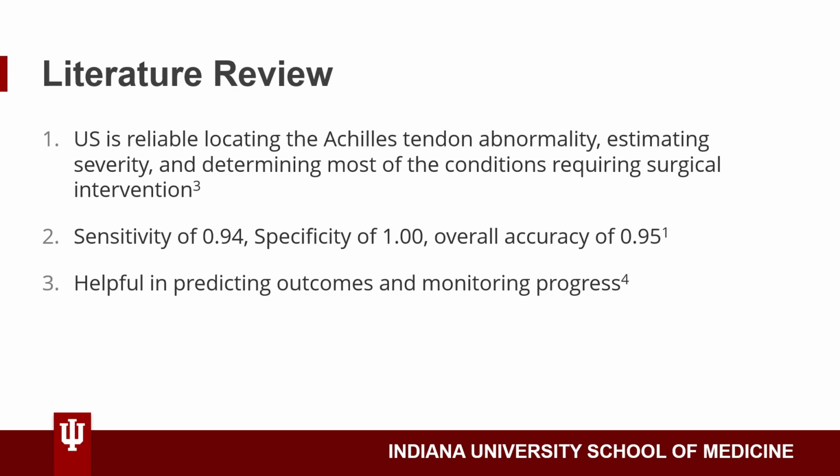Ultrasound can be relied upon for detecting Achilles tendon abnormalities and determining severity. In one study comparing preoperative ultrasounds to surgical findings in 79 patients, ultrasound was highly reliable for verifying a complete Achilles tendon rupture. Only one false negative ultrasound examination was found in the 26 surgically verified cases. Additionally, 6 out of the 8 cases of bursitis were found, and there were no false positives. Lastly, there were no false positive ultrasound findings in patients with peritendinitis or tendinitis.